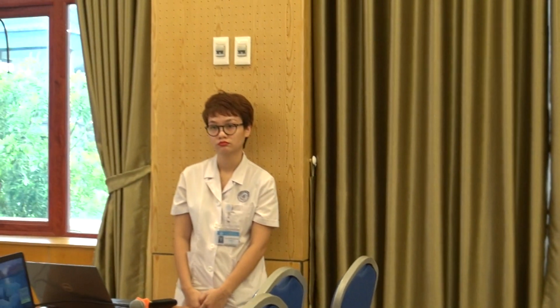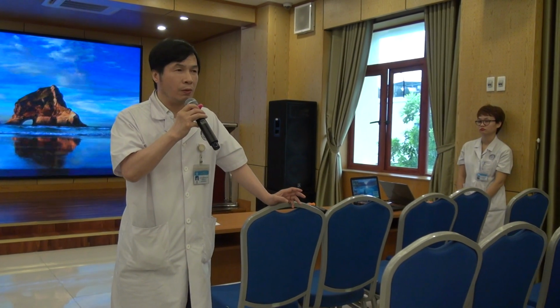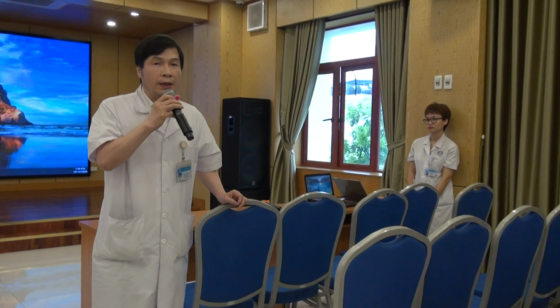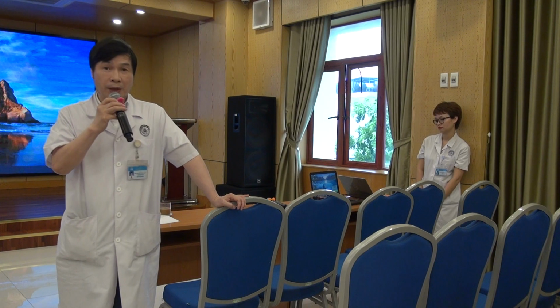So I noticed that nowadays in our hospital we have accommodative IOL, and in some places, even in Vietnam, we can use one kind of modern IOL, not bifocal, not multifocal, but in my experience I have used for some patients an accommodative IOL and progressive IOL.